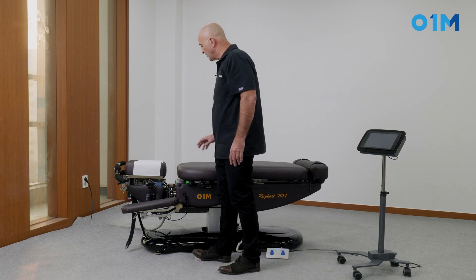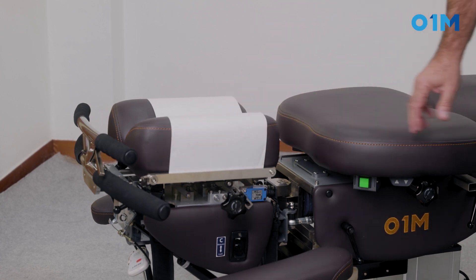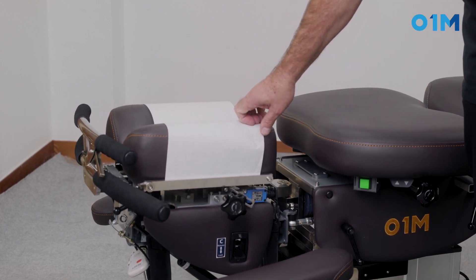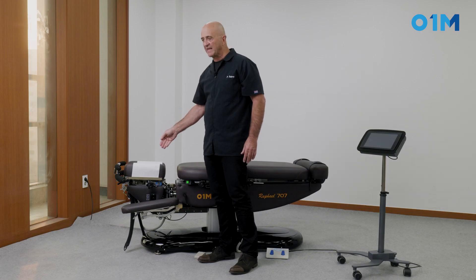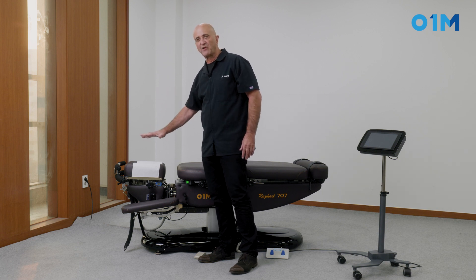You can see the plate drop in action — the whole headpiece raises up with no axle here, and you can see it goes down. That's typical of a plate drop. You can also have a plate drop with a cephalid translation, and some plate drops go straight down.